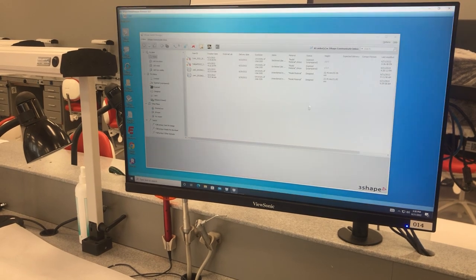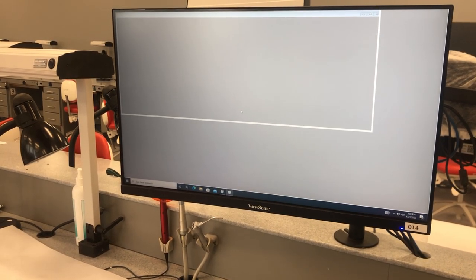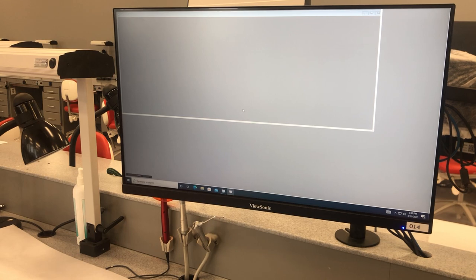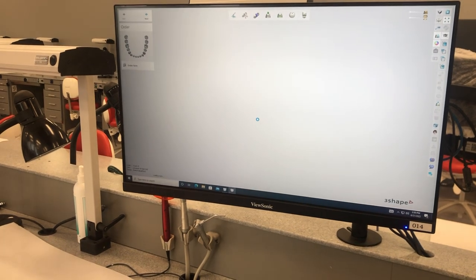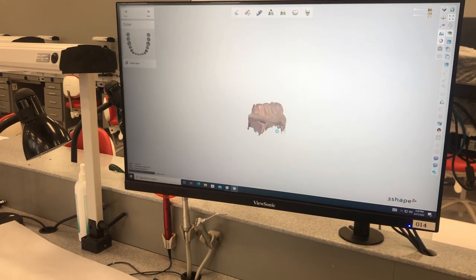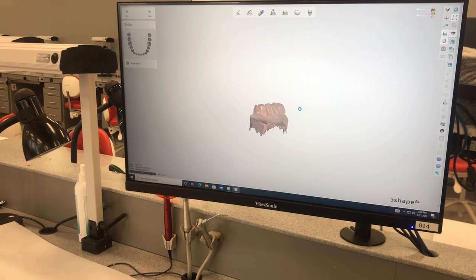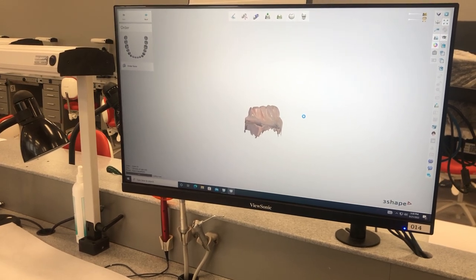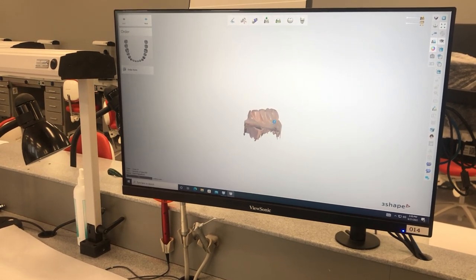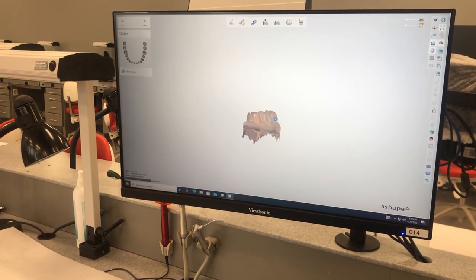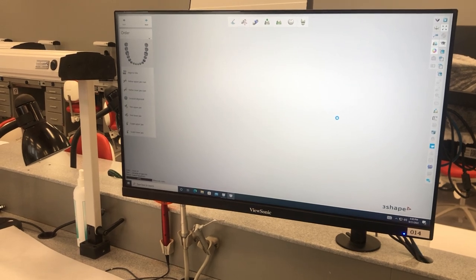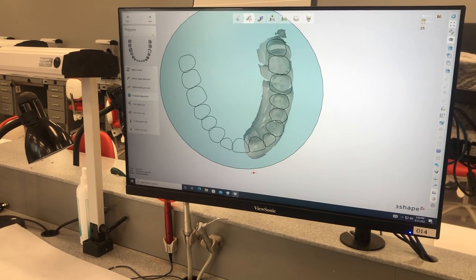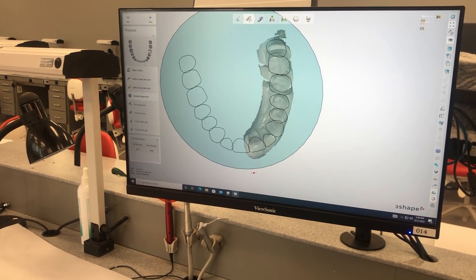This is the case that you're going to work on. You're going to double click on it. It's going to open the design software, and then you're going to go through as the other video showed on how to design the crown and where to put the contacts and all those kind of things. But that's how you get the case into our system from the 3Shape machine.